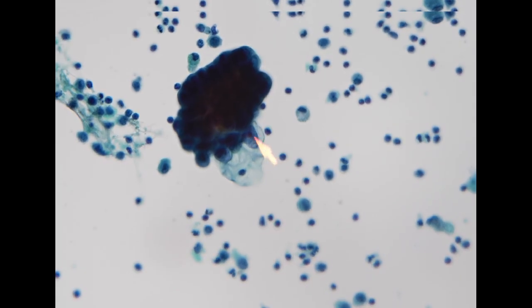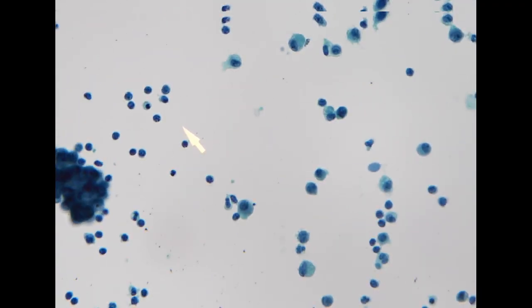The nuclei show prominent hyperchromasia with a very tight three-dimensional architecture. At the edges you can see through the nucleus, and you see a cherry red nucleoli and bubbly cytoplasm. So this is an adenocarcinoma.